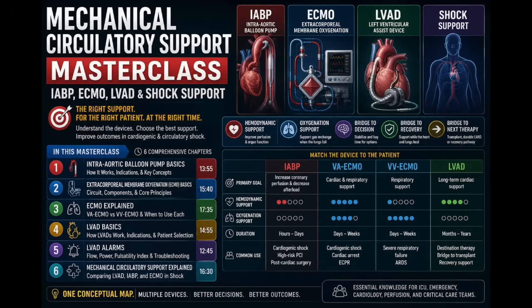Today, we're going to be talking about a really important topic. Mechanical circulatory support can be one of the more intimidating topics in emergency critical care medicine. Whether it's intra-aortic balloon pumps, ECMO, LVAD, or countless other acronyms that come with it, it's sometimes easy to get lost in the details, lose sight of that bigger picture.